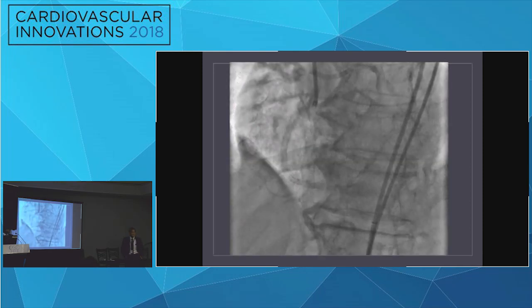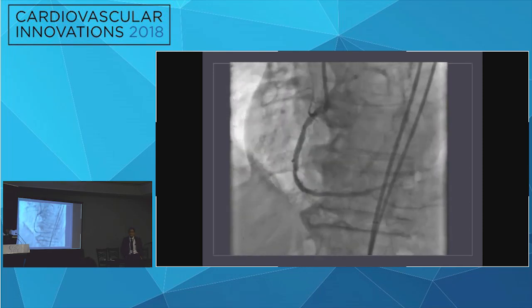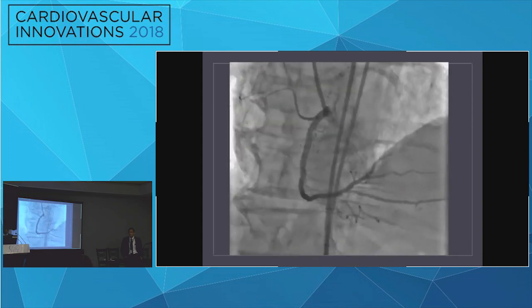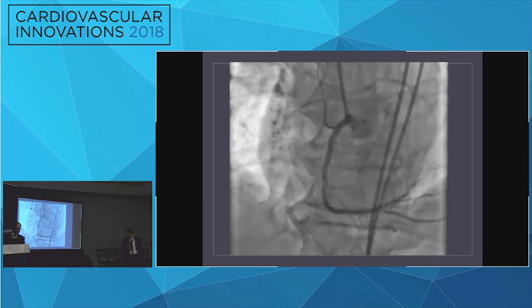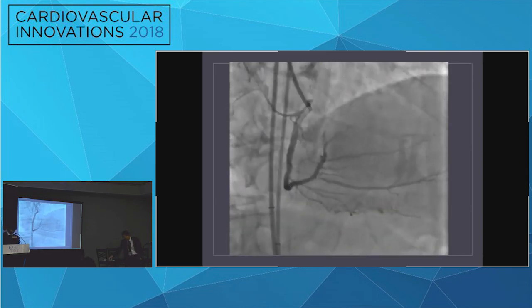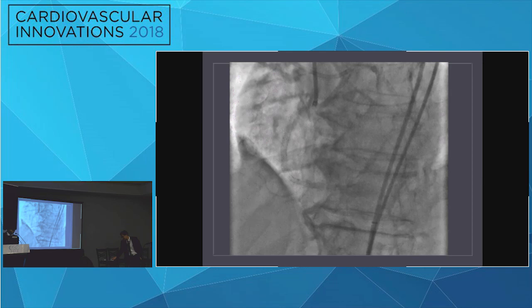In this one, you crossed it with Pilot 50? Pilot 50, yep. I think the case really highlights the classic approach: an ambiguous proximal cap really should go with a retrograde approach, and the PROGRESS CTO score has really shown that in the registry data.